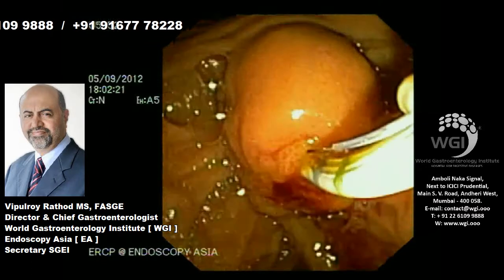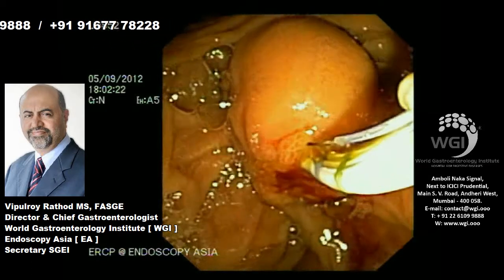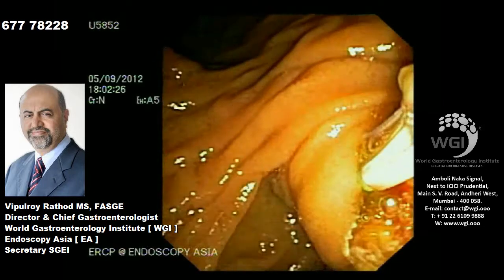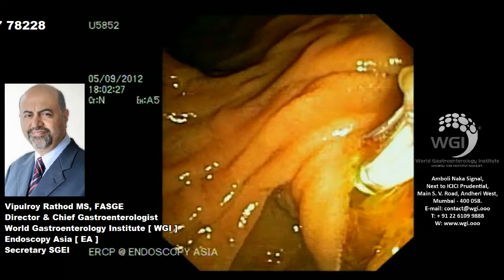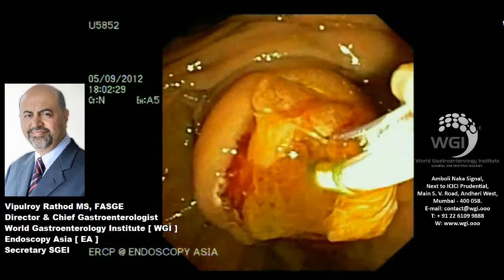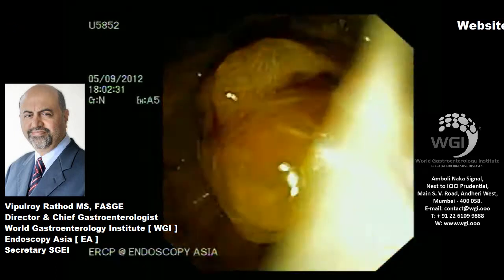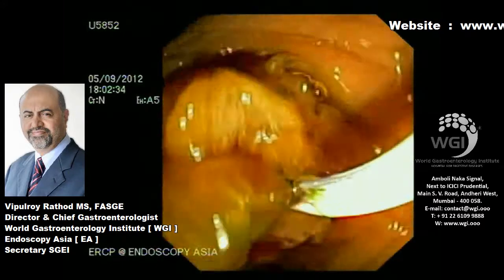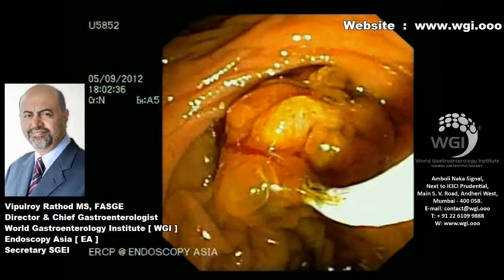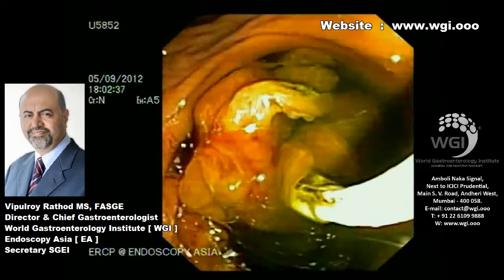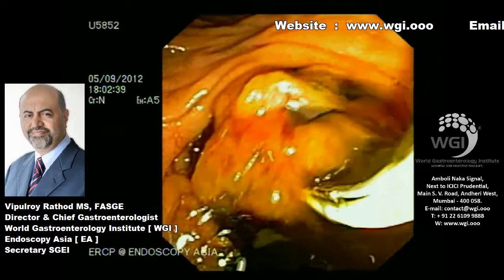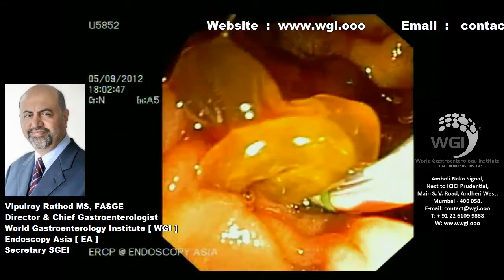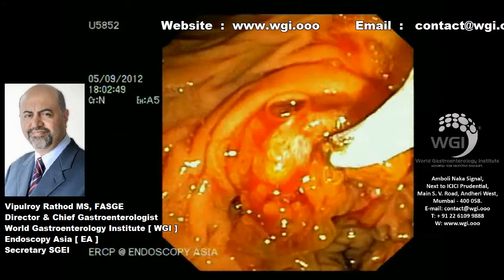It's always advisable to do a complete biliary sphincterotomy in such situations. If you try to take an ampullary biopsy without sphincterotomy, you may not get tissue representation. You can see I'm cutting across the entire length of the bulging ampulla, and you see how the tumor pops out with mucinous material along with dark bile oozing out once the sphincterotomy is complete.